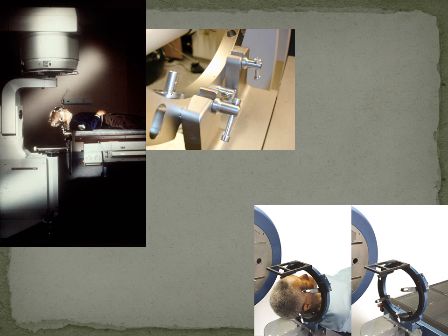We do the same thing for your BRW biopsies. We have targets. We know what they are. We check the stereotactic localizers. We check the head rings that you use down in CT, and we also check the BRW stands that you use, the phantom bases in the OR. And those also go through a similar type of QA process routinely.